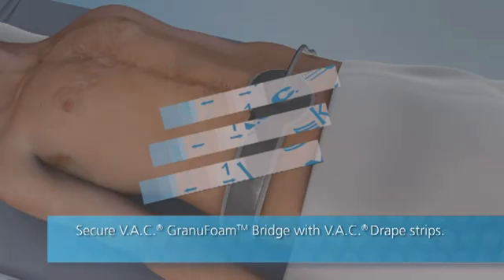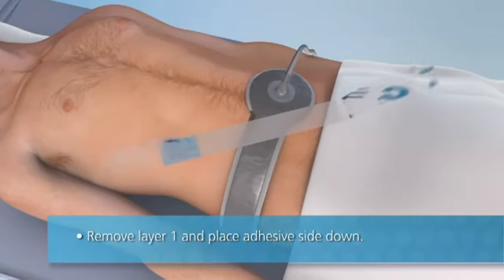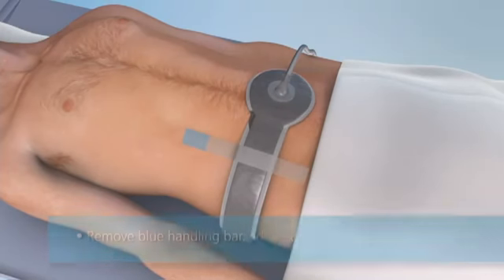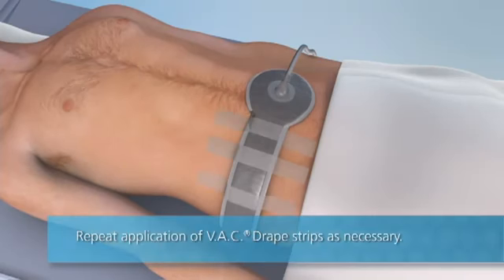Secure V.A.C GranuFoam bridge with V.A.C drape strips. Remove layer 1 and place adhesive side down. Secure drape strip to skin and remove layer 2. Remove blue handling bar. Repeat application of V.A.C drape strips as necessary.